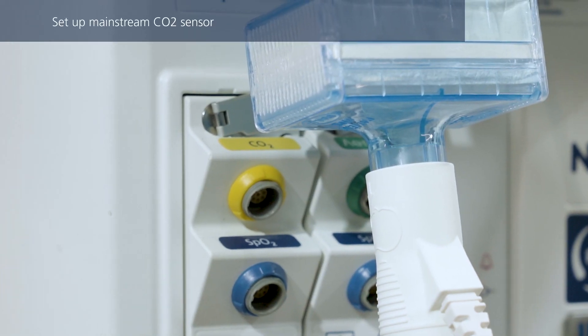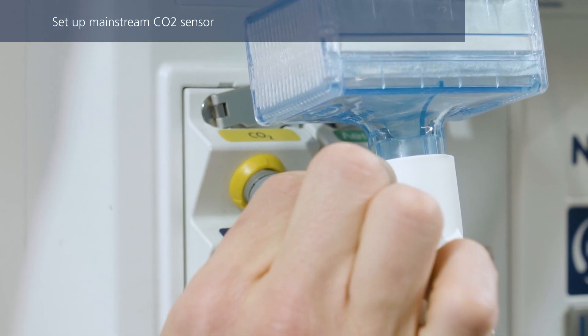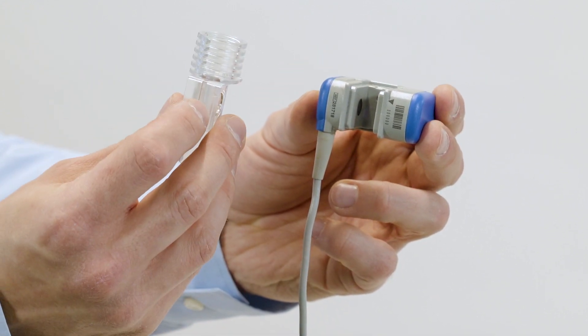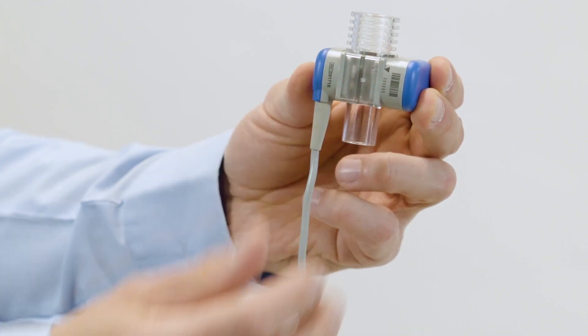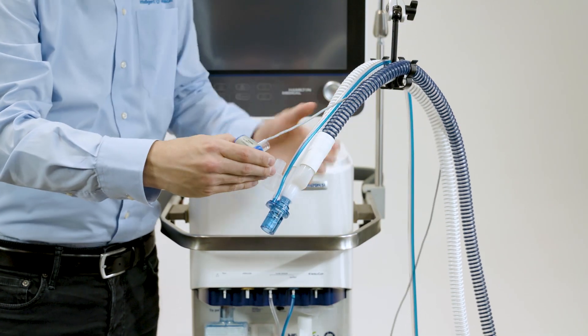If you are using a mainstream CO2 sensor, connect the sensor cable at this point to the corresponding connection port. Slide the CO2 sensor onto the airway adapter. Align the arrows on both components and press them together until you hear a click. Then connect the sensor with the airway adapter between the breathing circuit and the flow sensor.